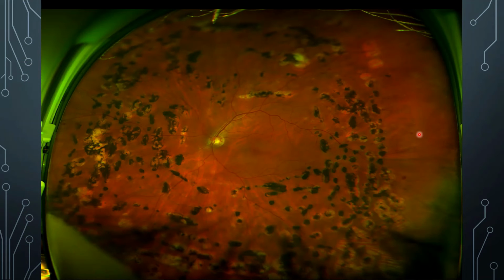Now, what's going on in here? This is a diabetic eye. You can see there's a hemorrhage here. If you look around, you'll see little dot hemorrhages and things. But you may be wondering, what are all these? Looks like cigarette burns on the retina. Why would that be there?